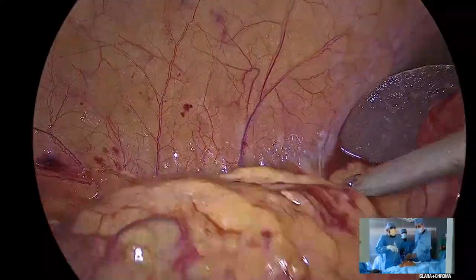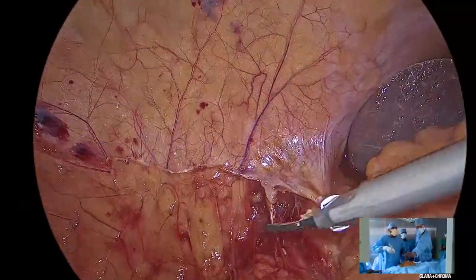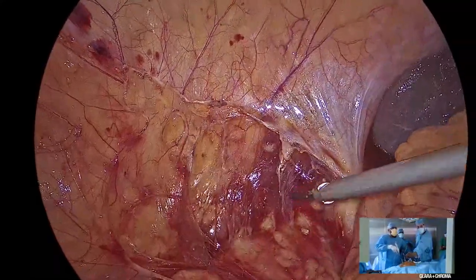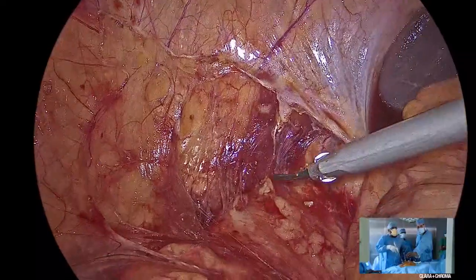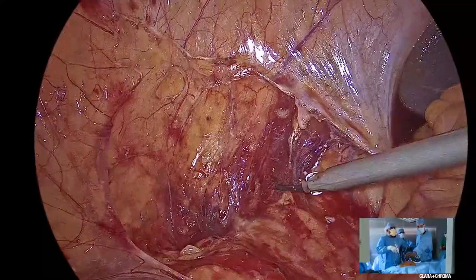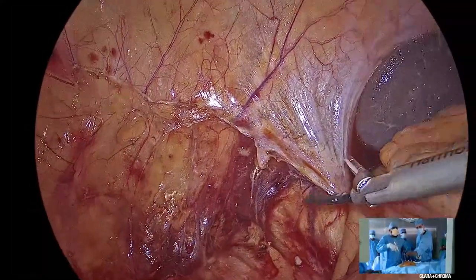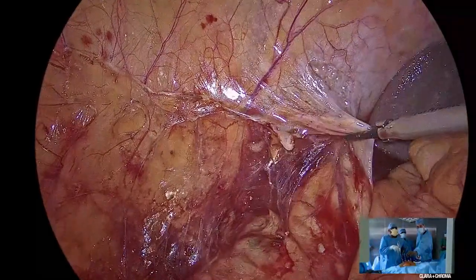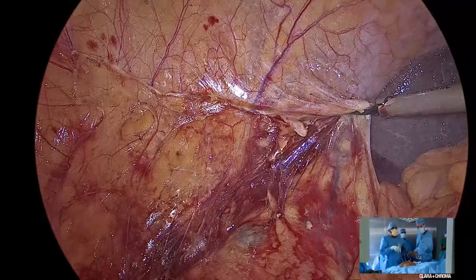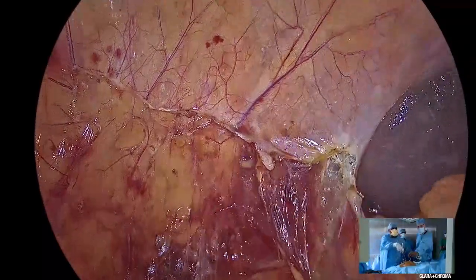So I agree with you. The evidence is not very clear cut as far as the CVL is concerned, but one thing is sure, the basic minimum is what you have done. I think that needs to be done. If you go a little higher than that, then you leave a lot of fibrofatty tissue. The exposure of the uncinate is not so clear, and that's the key to a good right hemicolectomy. The pattern of recurrence is usually in the colonic bed at the head of the pancreas. That's where the nodal recurrence is coming.